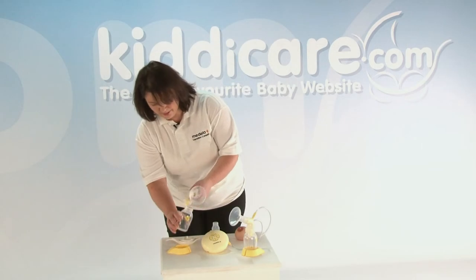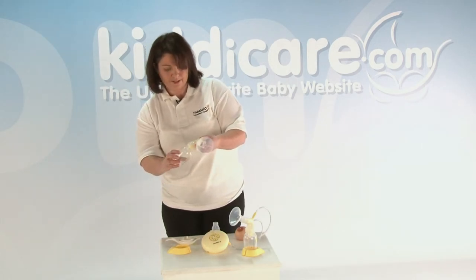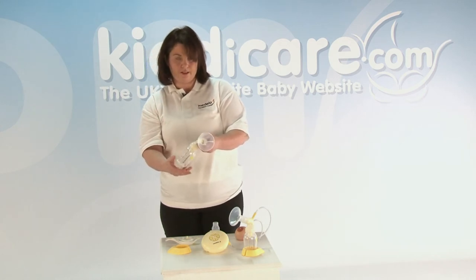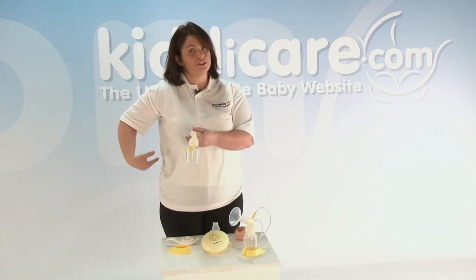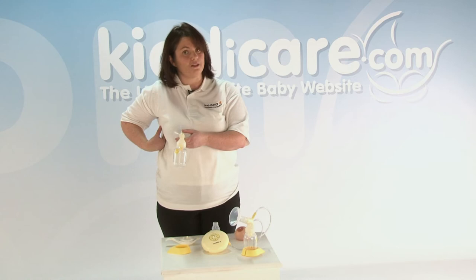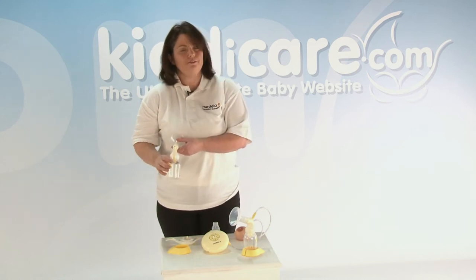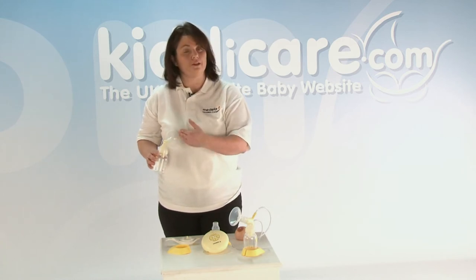Another tip is to make sure of the way that you're actually sitting. If you're sitting in a deep settee, you might be quite far reclined, and you might find that your milk is dripping around the back of your breast and not draining into the bottle very well. So sit fairly upright and make sure that the actual nipple is moving in and out comfortably.